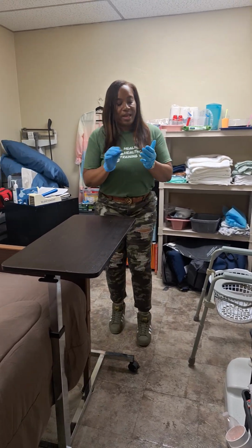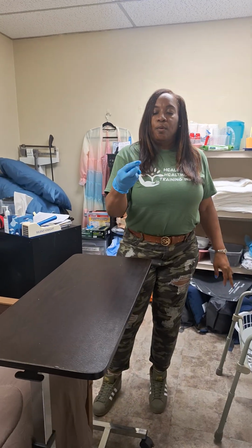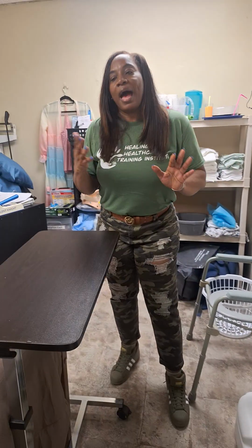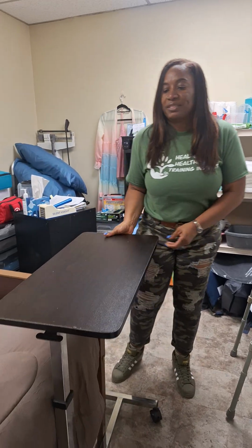Now I have to remove my gloves. So I'm going to pinch my gloves in the middle, ball that up, discard them into the trash. I sanitized before I started, so now I can touch everything and go fix Miss Allen up.